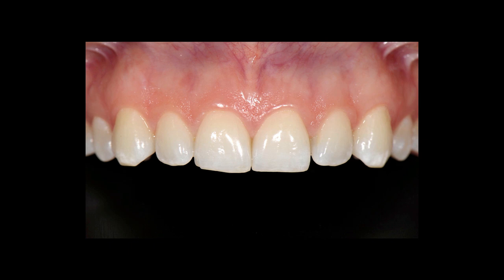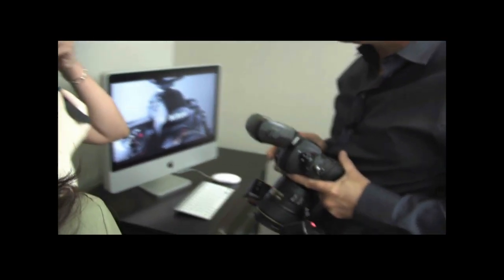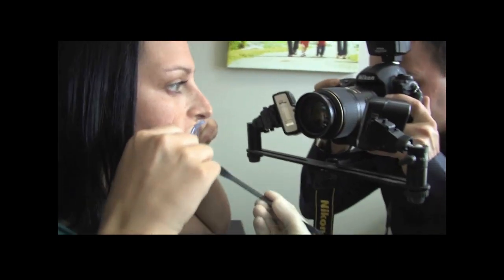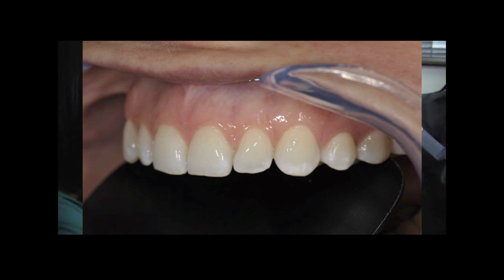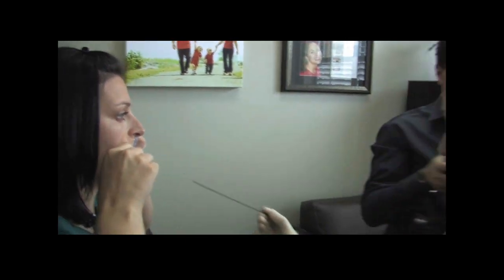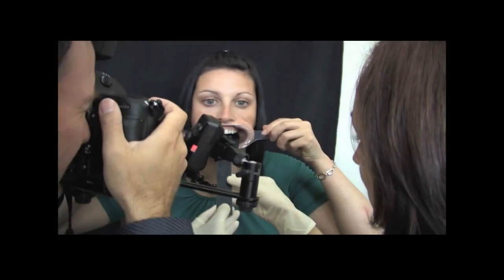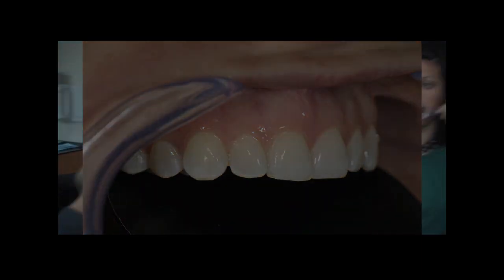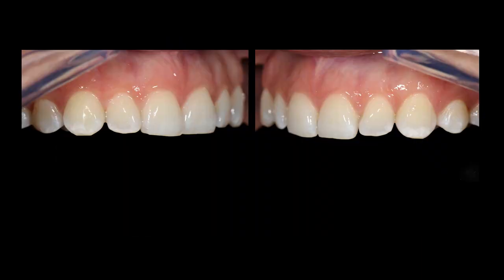Now I'd like to talk about the lateral views and show you a video clip from my DVD about those. We've got our exposure compensation set. That looks good. We'll come over here and do this one. And this one looks good. Here are the lateral views — again I've cropped them in slightly to achieve the edit of the image I'd like.